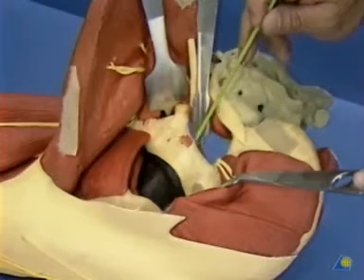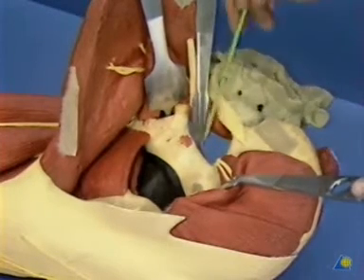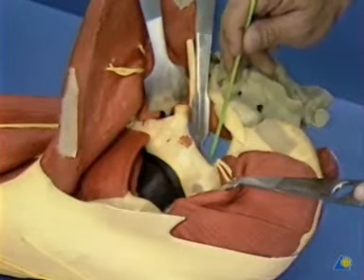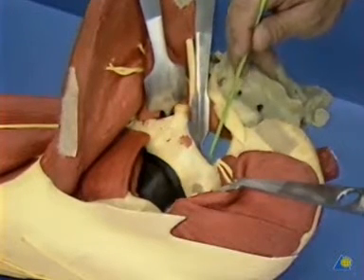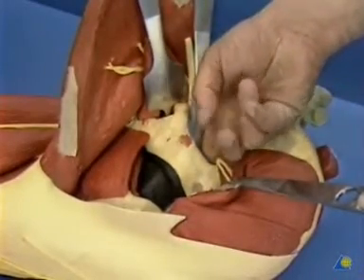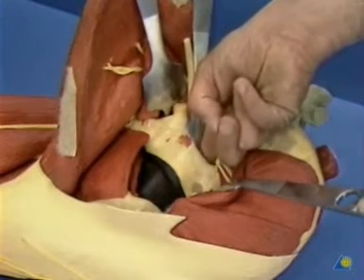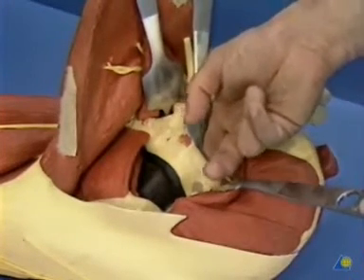Through the greater sciatic notch, we get access to the quadrilateral surface, the inner wall of the pelvis, and also to the pelvic brim and anterior column. There is a limited access for palpation to assess the reduction, or sometimes even to place a reduction clamp through the greater notch to the pelvic brim and anterior column.